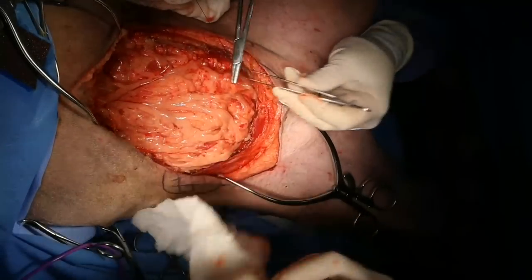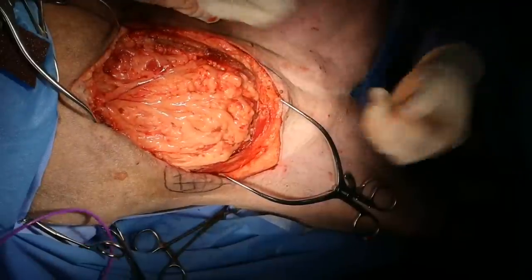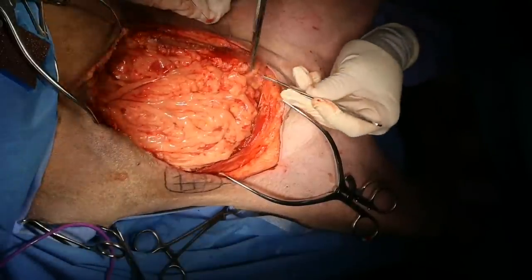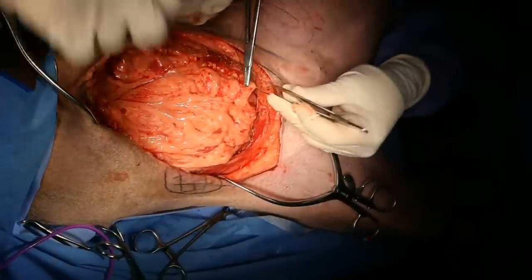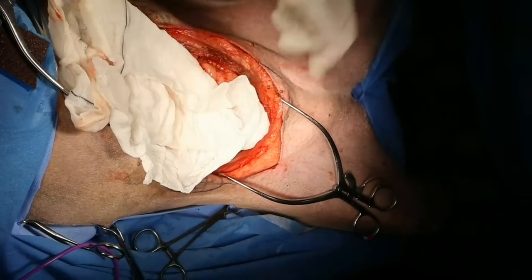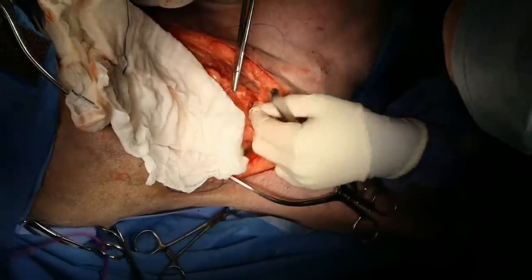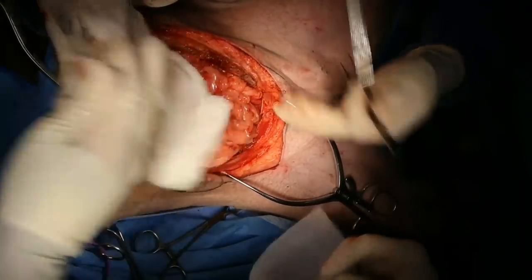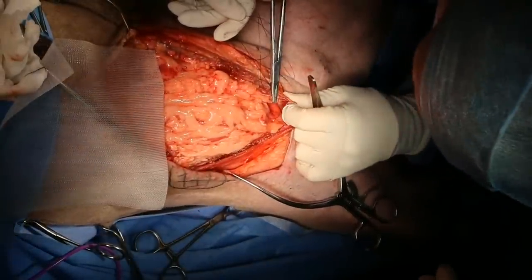So can we get our polypropylene mesh, please? So, a really nice omental sling. There's a question, something about histopathological results, especially in the clean margins. I'll have to go back and read that because I can't see it right now. That one should be fine. Yeah, the smaller one. Thank you. So this is our polypropylene mesh here. Let's start rounding that off a little bit.